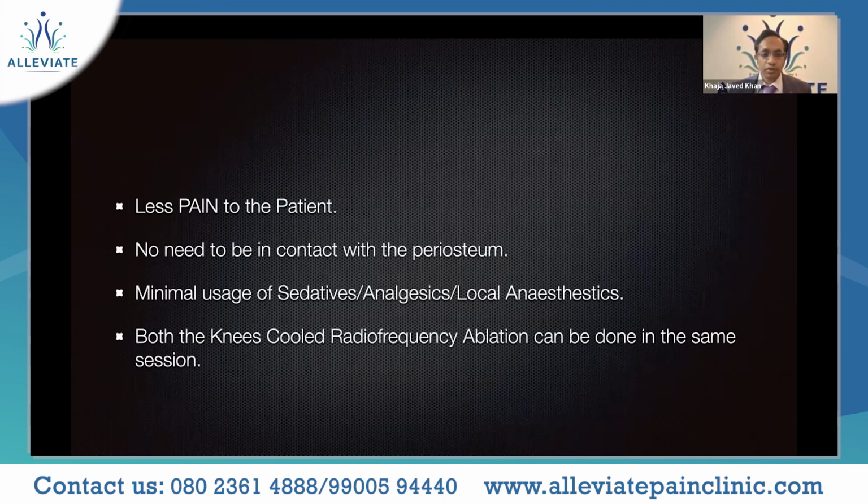There's no need to be in contact with the periosteum. This is a very important thing. When we are doing the procedure under fluoroscopy, remember, you are hitting the bone and then scratching the bone so that you reach the middle of the shaft. Whereas there is no need for this when you are using ultrasound. You can avoid the contact with the periosteum, and believe me, the pain will be very, very less for the patient.